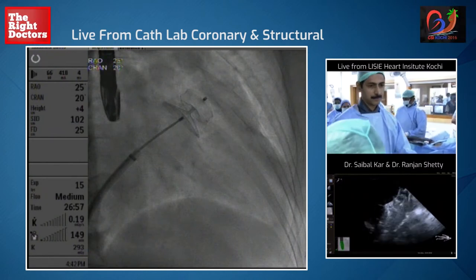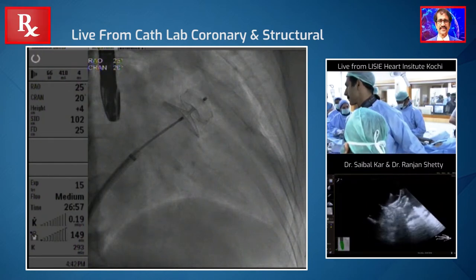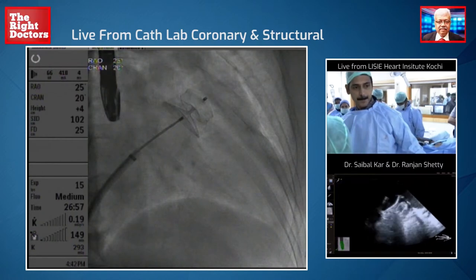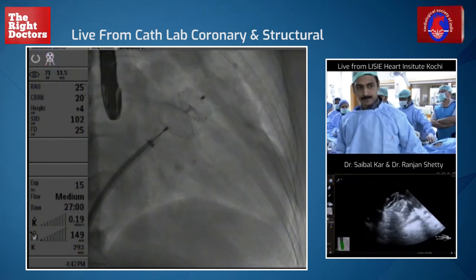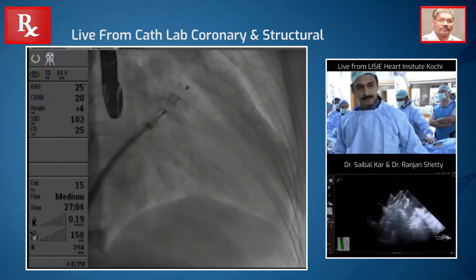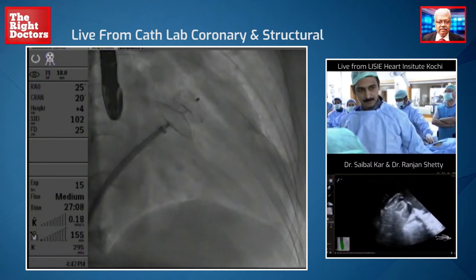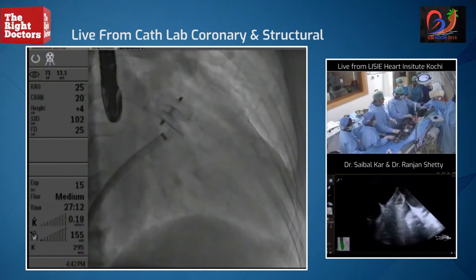So let's do 45, 135 and then I think we'll deploy. Let's get ready to deploy. So does the audience like this? We are releasing it — let's take the sheath a little in. We'll release it. It looks really good. We have already released it, and it looks absolutely perfect by angiogram. And now we're doing one more last angiogram.